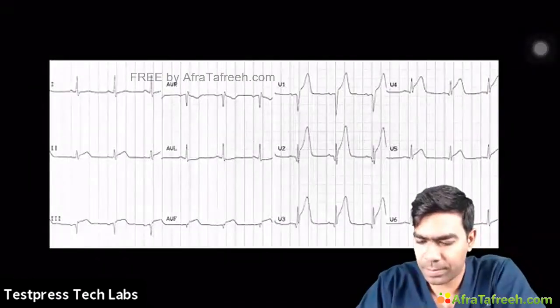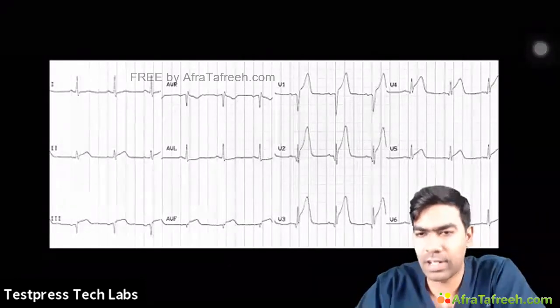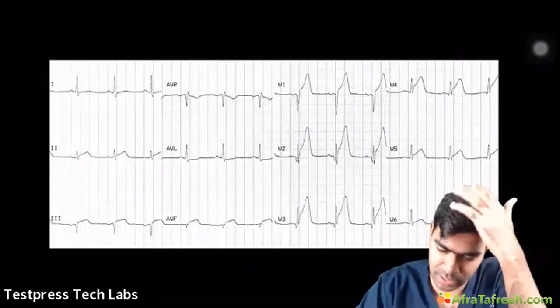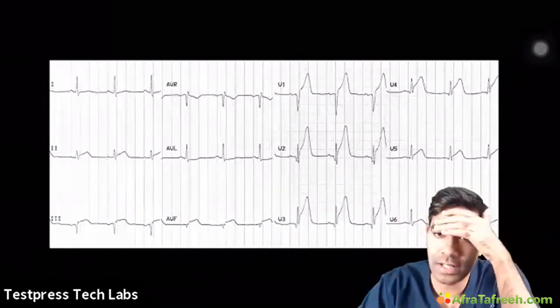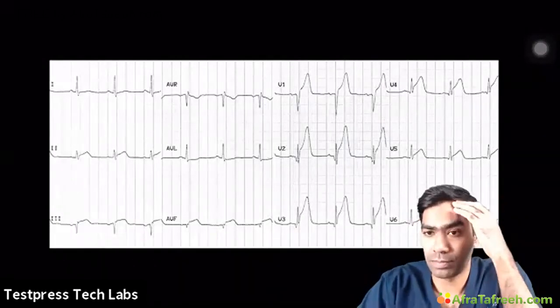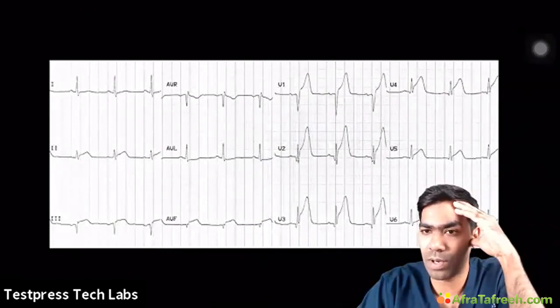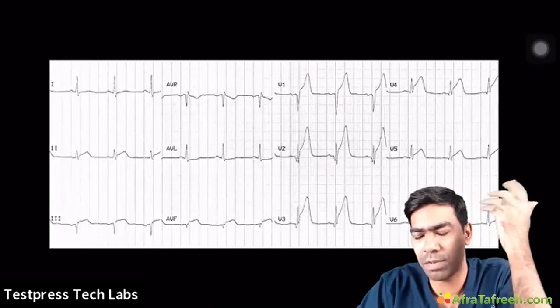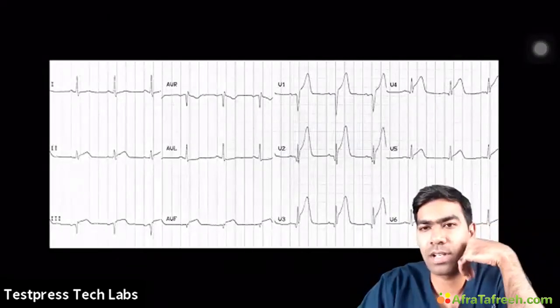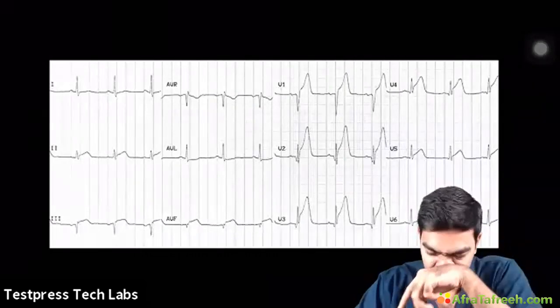So what is this one? It's an interesting one, a curious one, isn't it? What you're seeing here is again hyperacute T waves, but where are you seeing hyperacute T waves and what is the MI that is seen? Yeah, proximal to S1, we would have seen RBBB. There is no RBBB there, so it's not proximal to S1. Ishan is correct. Okay, so what is the MI here?